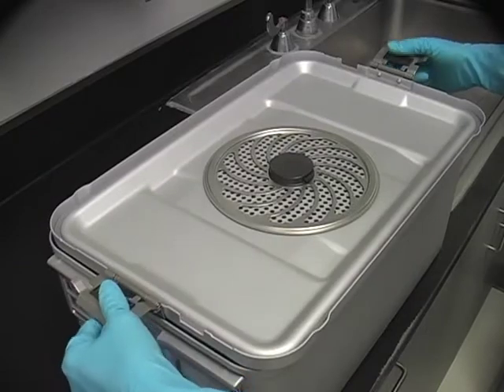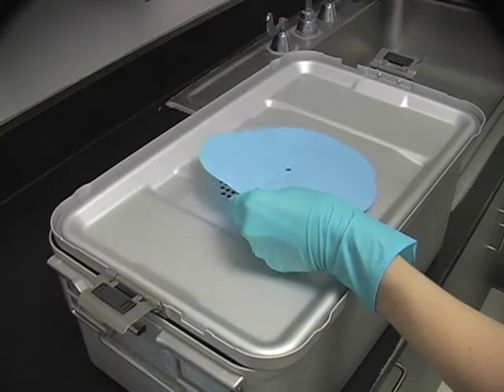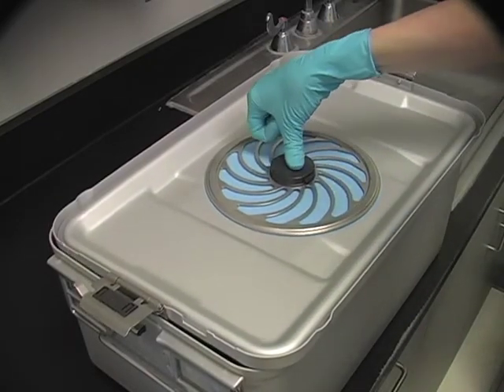To load the filter paper, first remove the retention plate from the perforated section. To secure the filter paper, place the retention plate over the filter paper and press down until locked into place.